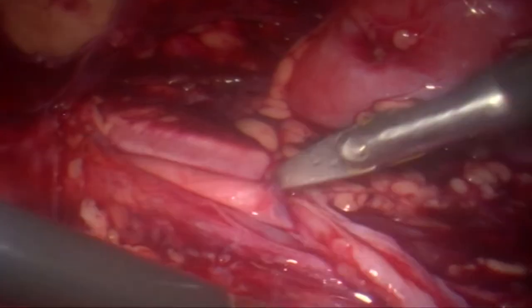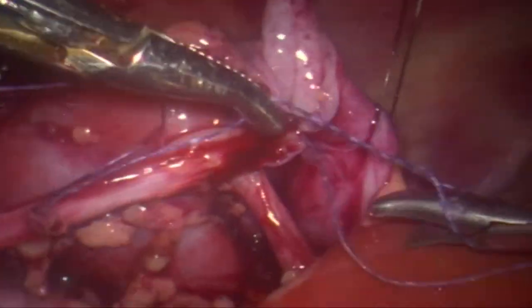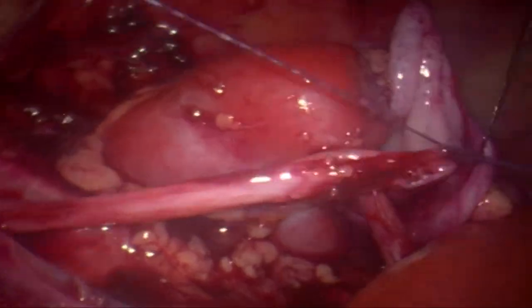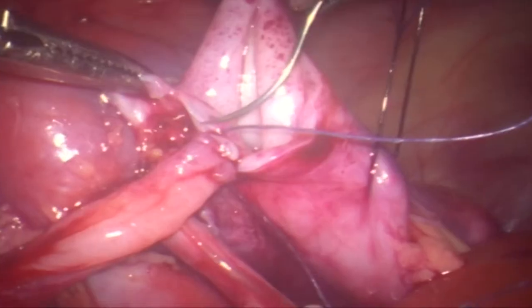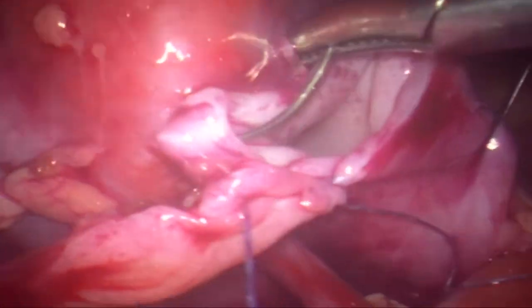That is spatulation of the ureter. You can see the nice mucosal rugosity here. In this case, we are going to start the anastomosis from the top, unlike a conventional anastomosis. From the top, we are doing a continuous 5-0 vicryl anastomosis.